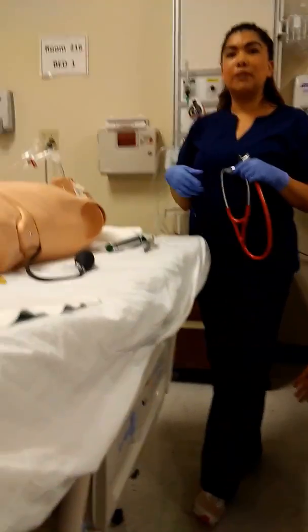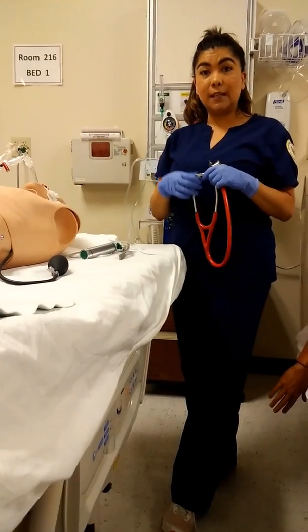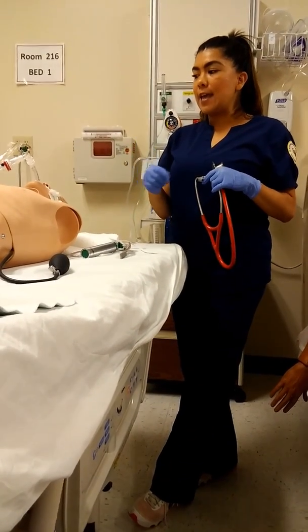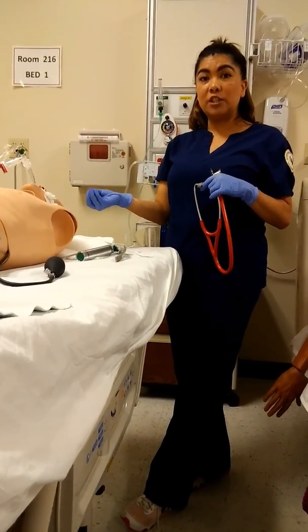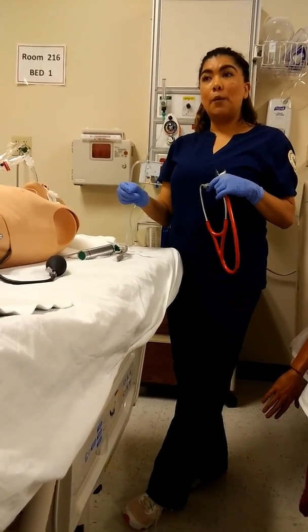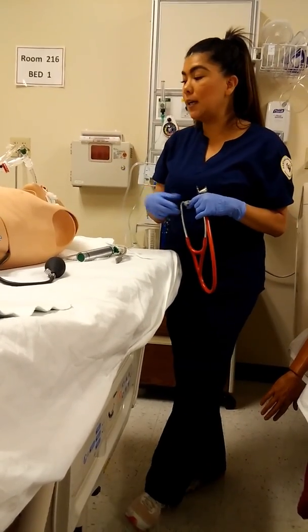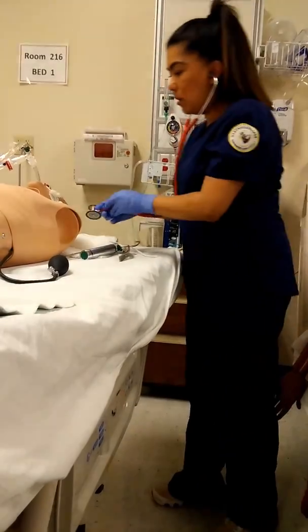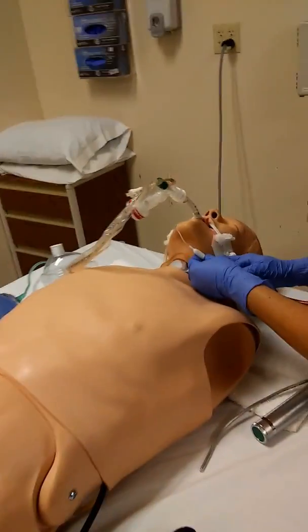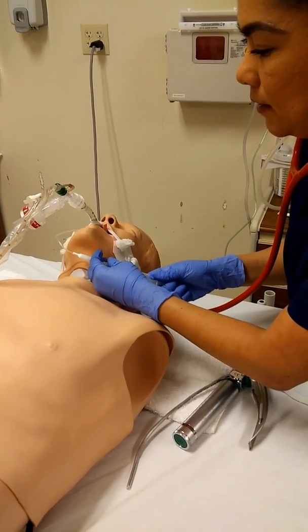And a minimal leak will be if it's occluded too much, then we would go ahead and deflate the cuff a little bit just until we hear a slight leak. So that's the minimal leak technique. If the cuff is deflated too much, then we would go ahead and inflate the cuff just a little enough so that we could only hear a minimal leak in the airway. So we could just go ahead and check it, and then if we need to release a little bit during the minimal leak, then we just deflate it a little bit.